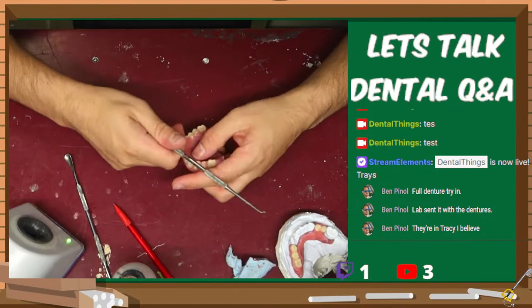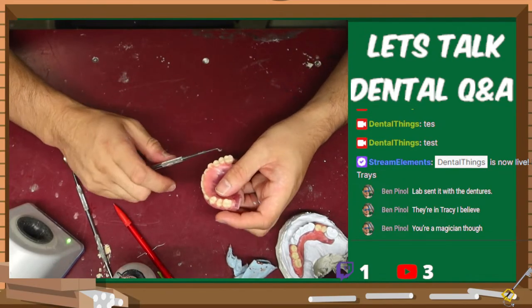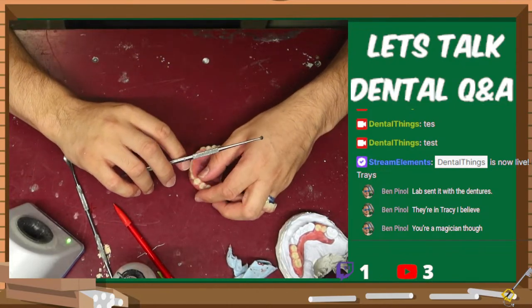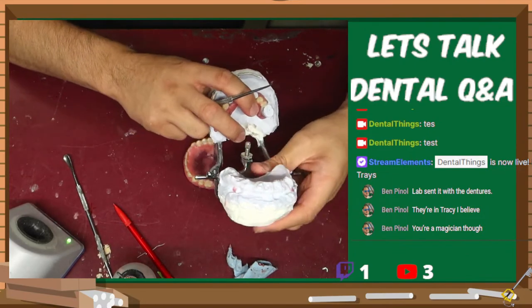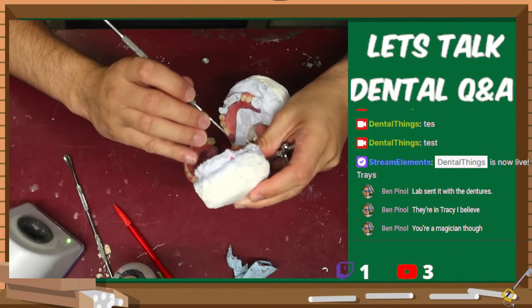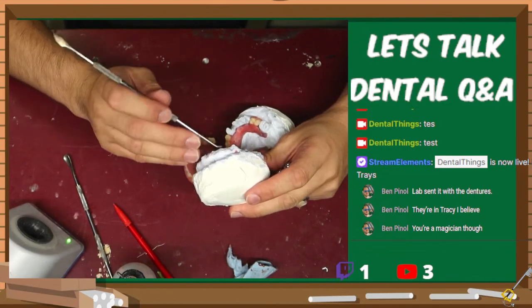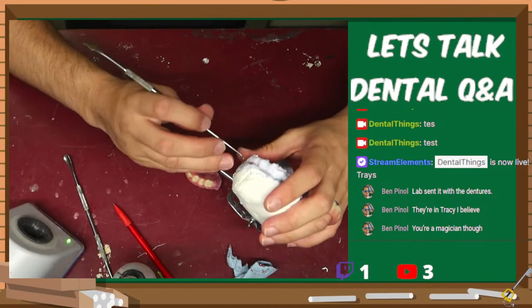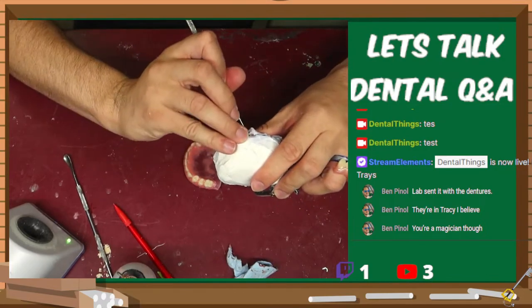I wish I had a custom tray. I wish I had a wash impression. Yeah, I know. My wands are all spread out across this table. Even this cast that I got right here, bubbles were everywhere. It wasn't poured up that great. I want more vestibule and I would love to get more, but for these first couple of steps, I'm just gonna make it work for the most part.